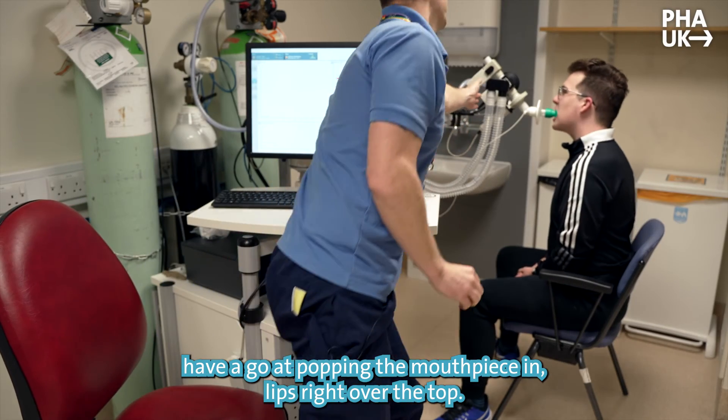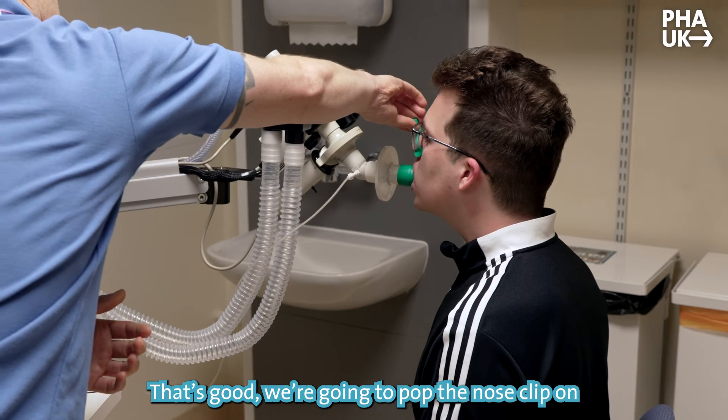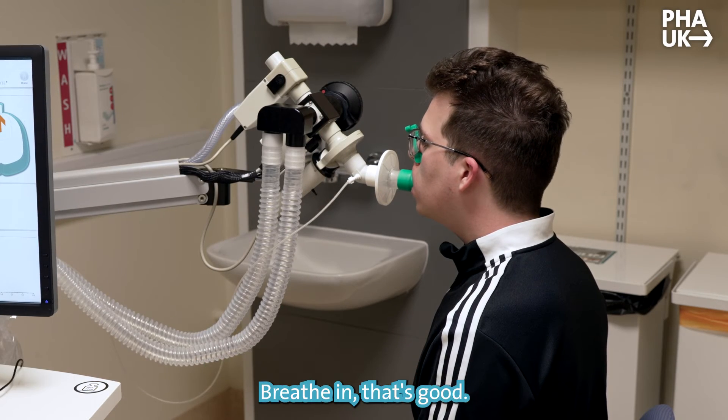When you're ready, go ahead and pop the mouthpiece in — lips right over the top. That's good. We're going to pop the nose clip on and breathe normally, just in and out, nice and relaxed breathing. That's good.